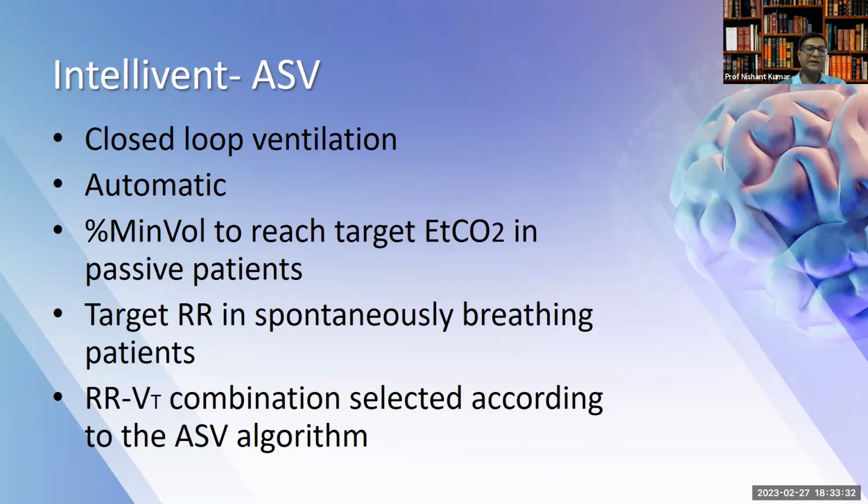So it's almost like that Hero Honda ad: fill it, shut it, and forget it. The main thing is that you feed in the condition to the ventilator, and the rest of the things will be done by the ventilator. Although it doesn't translate like that practically, you have to monitor each and everything that you're doing. You just cannot leave everything to the ventilator to be taken care of.